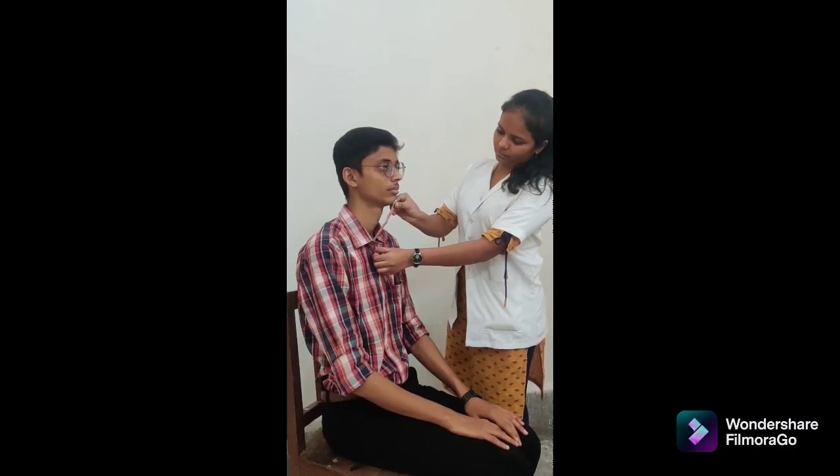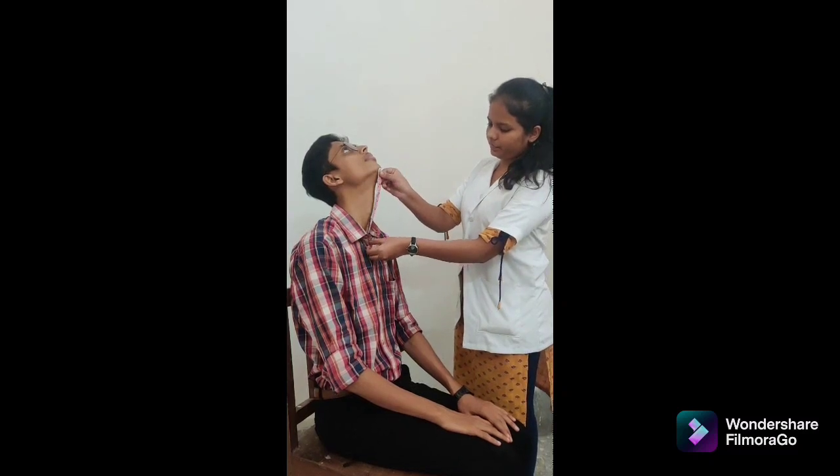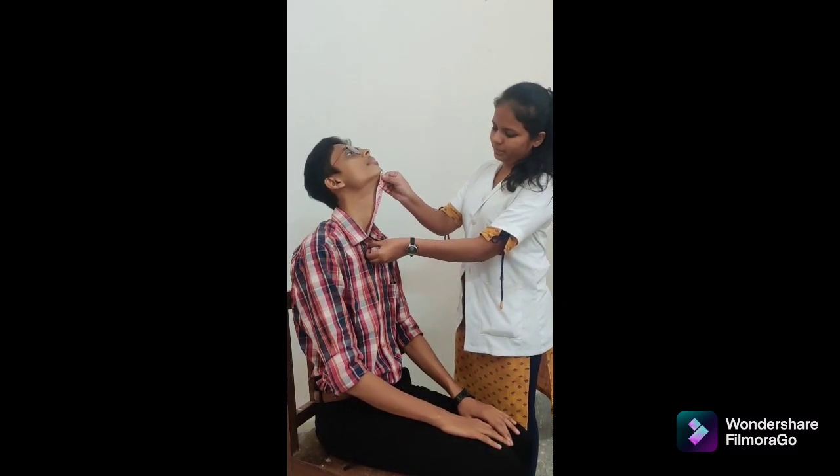We are going to perform cervical extension with tape. Patient position: high seating with thoracic and lumbar spine supported by back of chair. Tape alignment: place one mark over the middle of the tip of chin and another on the lower edge of the sternal notch. Measure the distance between tip of chin and sternal notch. Instruction: bend the head into extension; patient's mouth remains closed during the motion. Measure the difference between beginning and end of range of motion.